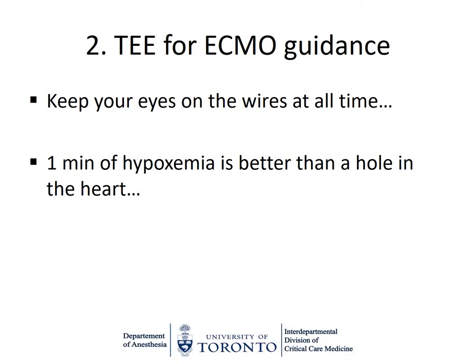So the summary on the TEE guidance part: really, you want to keep your eyes on these wires at all times. It seems like it's not a huge procedure, and most of the time it's actually straightforward. But if you don't keep your eyes on the wires, they may be in the right position in the first place, but then with dilations, end up in the right ventricle, and if you advance the cannula while the wire is in the right ventricle, then unfortunately you may have a catastrophe. And as I say to my trainees, it's better to take a couple of minutes and check that the wires are in the right position than to have a hole in the heart.